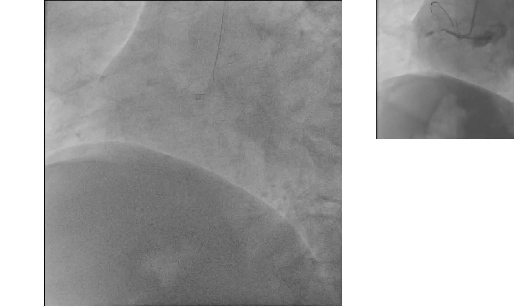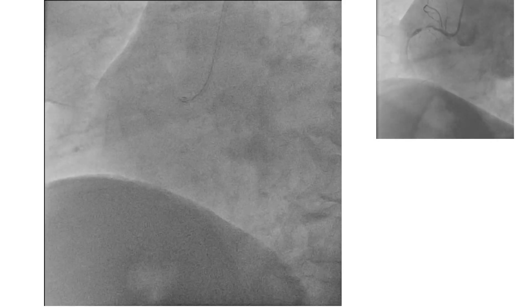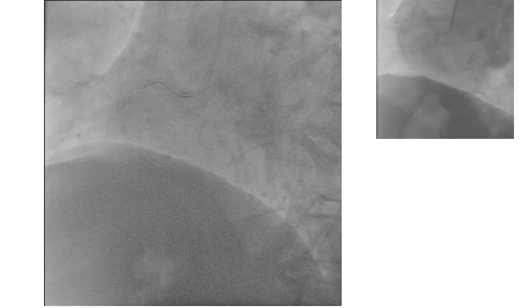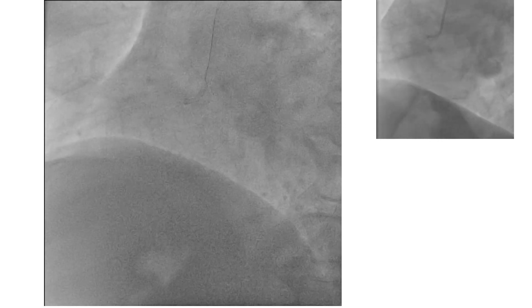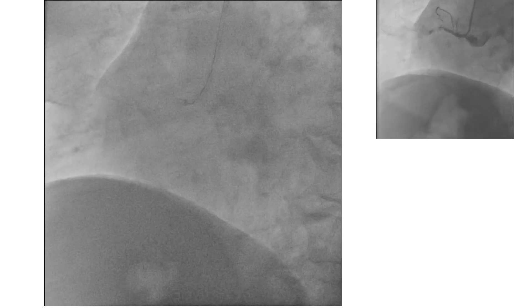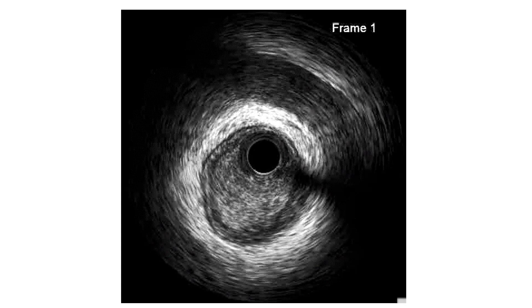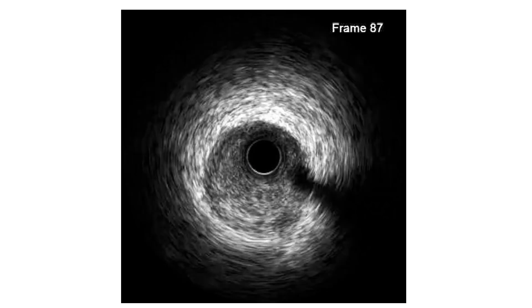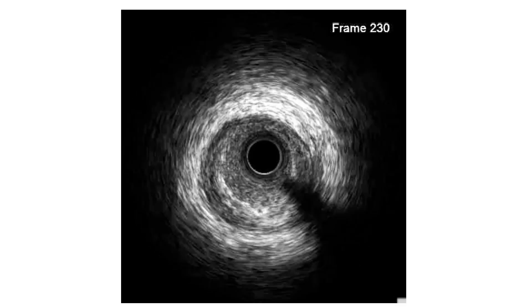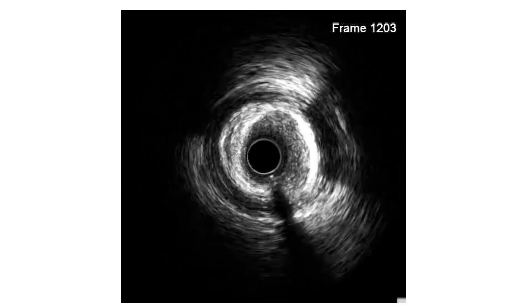We started with the RCA. Engagement was confirmed without contrast using the location and wire course with the diagnostic angiogram as a roadmap. After passing the wire, IVUS was done — this is the pullback. It showed a lesion in the mid-part of the RCA that was not identified by diagnostic angiography.